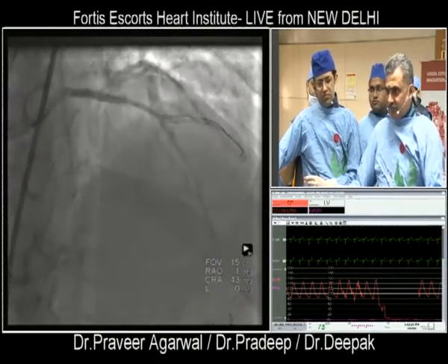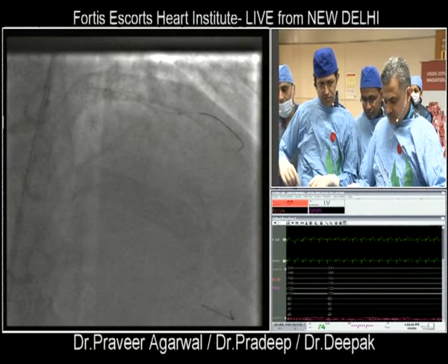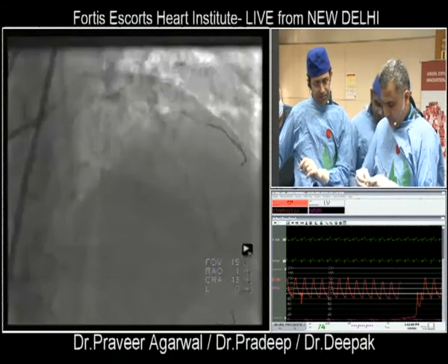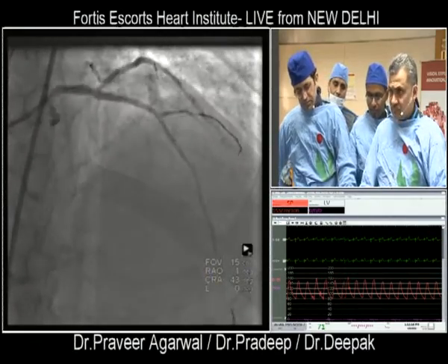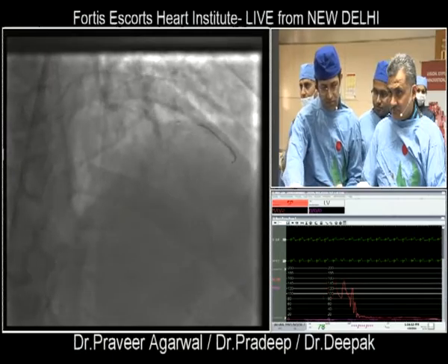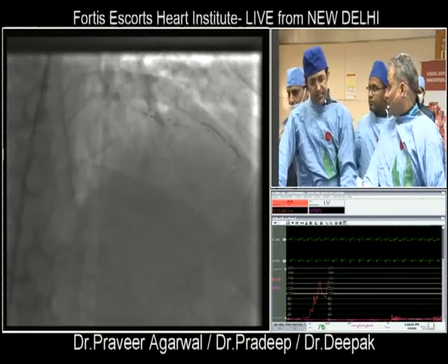So I think we should just go into the diagonal with the same scoring balloon. So what length of the stent we should choose? What length and what diameter? We were just discussing here, and there is the preference for a 40, because you have 39 length between the two stents, and probably 3.0, 2.5, if I can speak for the group. Do we have 3.0, 2.5, 40?